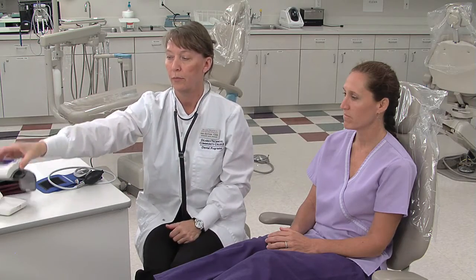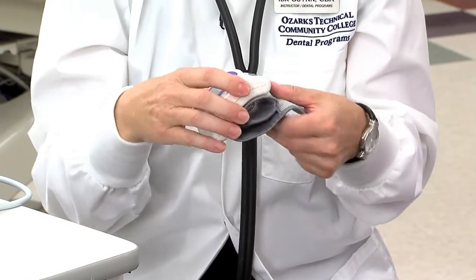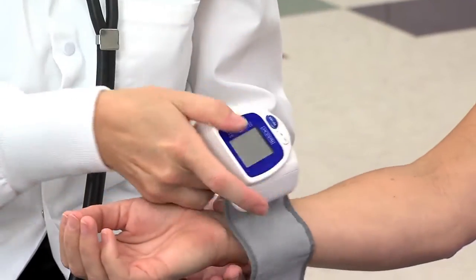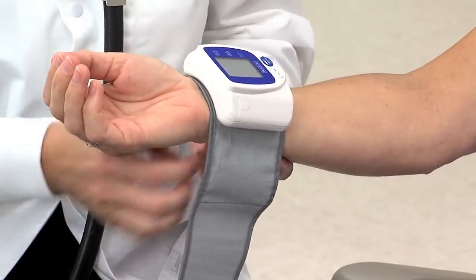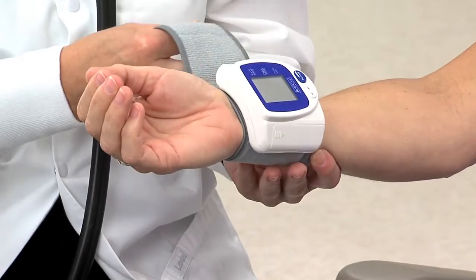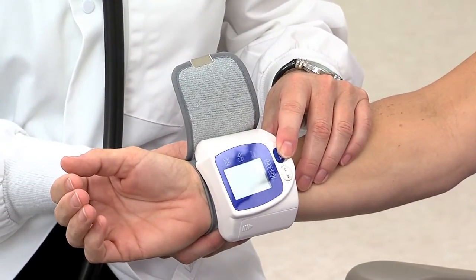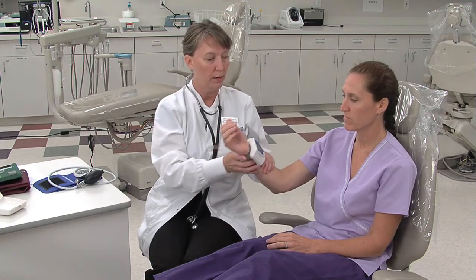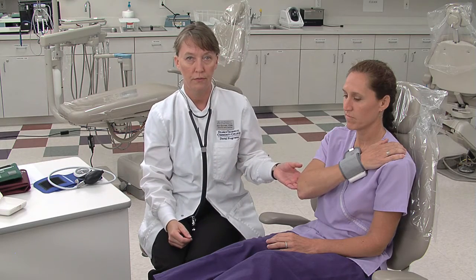The other type of blood pressure cuff is the wrist cuff. This particular type of sphygmomanometer rests on the patient's wrist. It is tightened, and then there is an on and off button that is pressed. During this type of blood pressure, you want to have the patient rest their arm on the opposite shoulder and make sure that the legs are uncrossed.